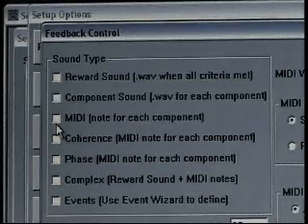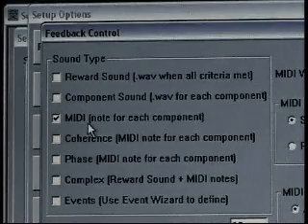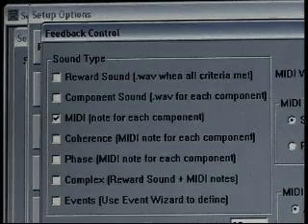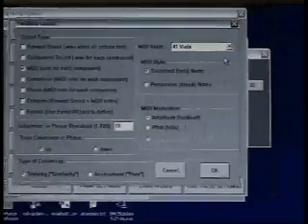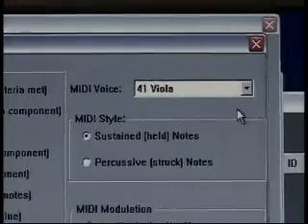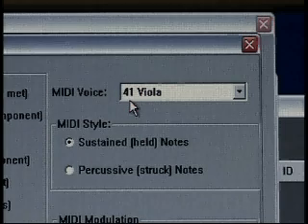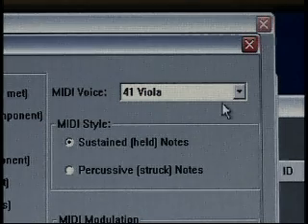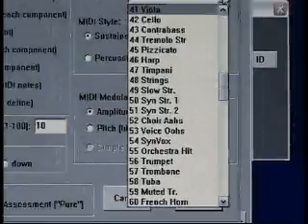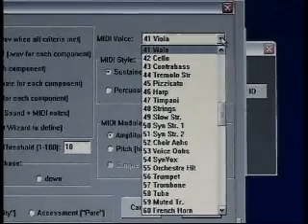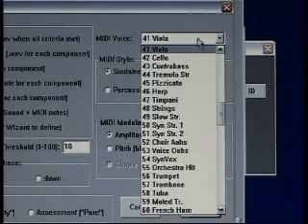As we come down to the next option, here's where the complexity begins to come in. As we choose MIDI, we see the definition — it's a note for each component. Sliding over to the right and up to the top, we have a couple choices for MIDI. Zooming in on the MIDI voice box, we notice a number — it's 41. There are actually 128 different sounds in this drop-down menu; we just happen to be on viola. Clicking the drop-down arrow, we notice a long list of different instruments. You're going to have to hear and experiment to find your personal preference. For now, let's leave it on viola.